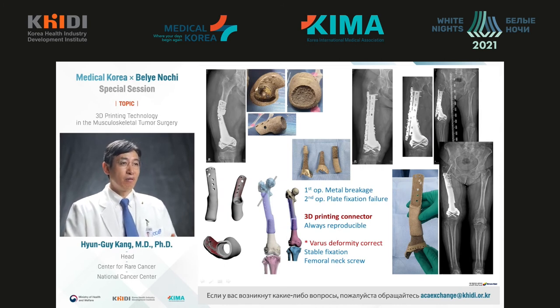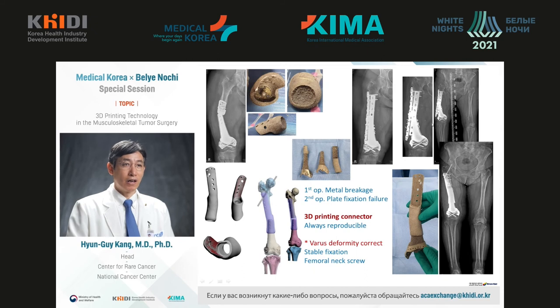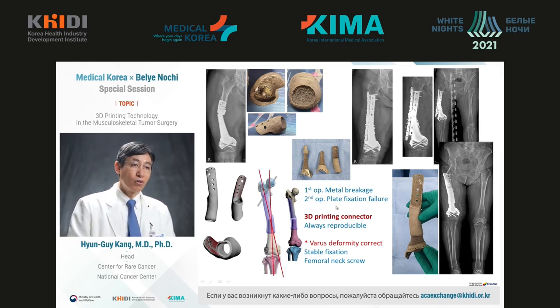Regretfully, during training, the 3D implant got broken. We did emergency surgery with a double plate, but fixation wasn't successful. So we created a connector, which we printed with a 3D printer, connecting the existing implant and normal bone. Along with that, we corrected varus deformity and aligned the mechanical and anatomical axis.